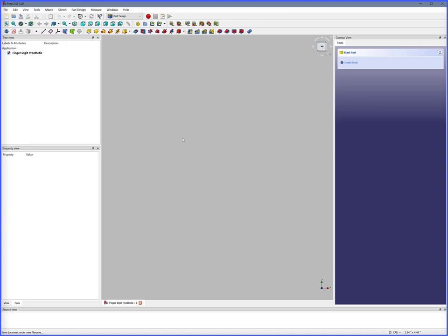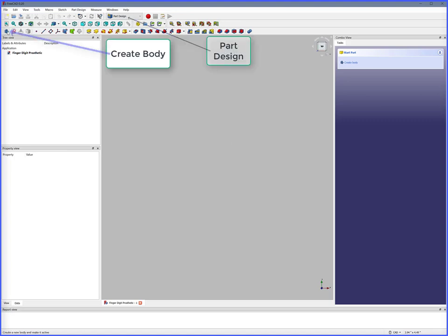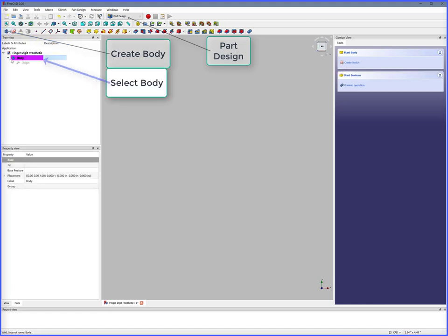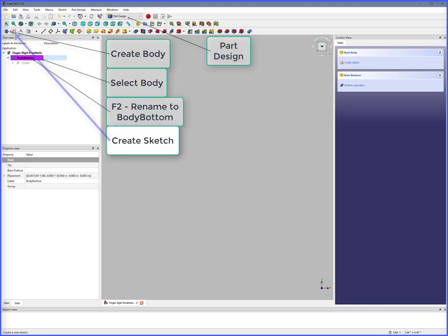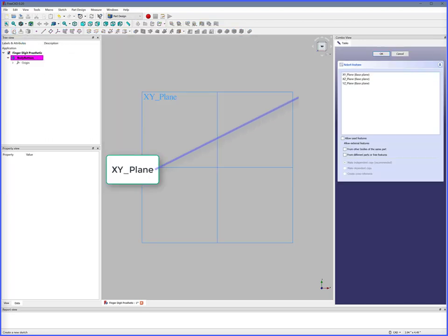To create the elliptical hollow cylinder: Part Design, Create Body, Select Body, F2 to rename body to Body Bottom, Create Sketch, XY Plane, OK.